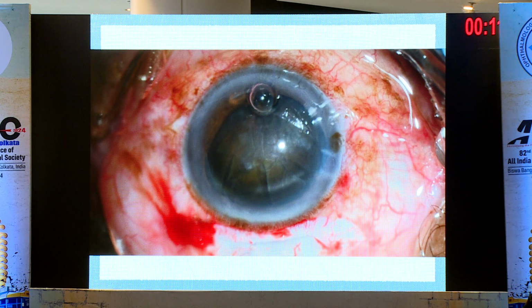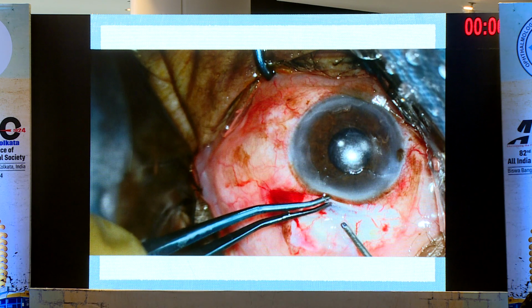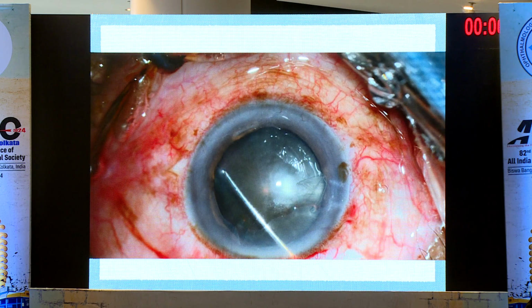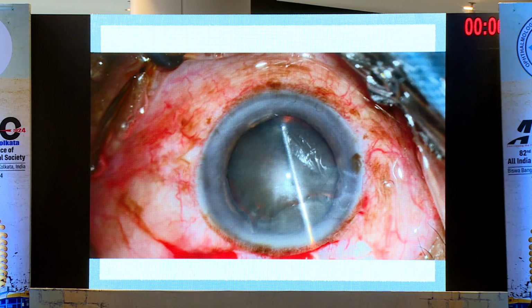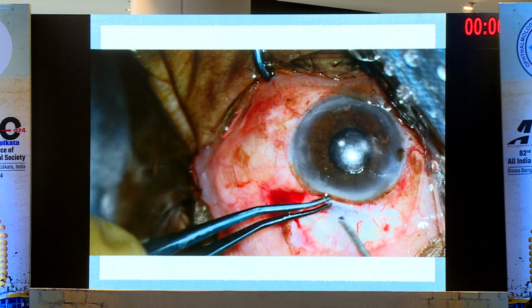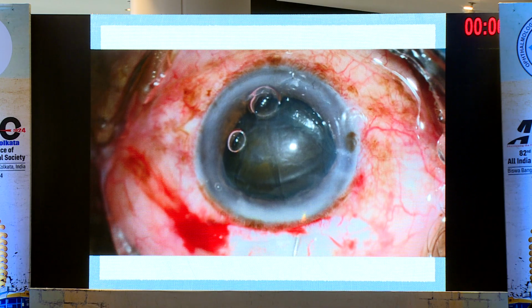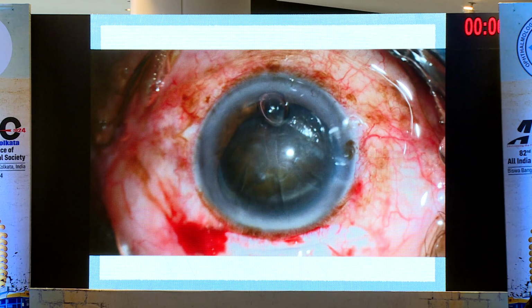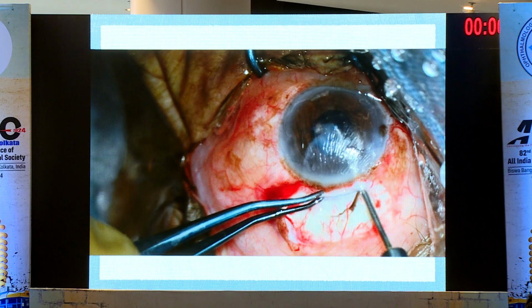So you can see that I've done a large rhexis, prolapsed the superior pole of the nucleus out, and then, I'm sorry, in this particular instance, I took off the DM first, but you could also do it after your intraocular lens is implanted. So this video should have come earlier, and then the nucleus removal. And then finally, after you've implanted the lens, you put in your DSEK graft.